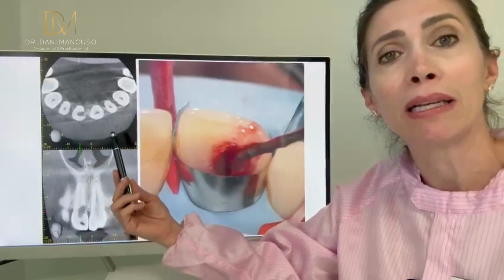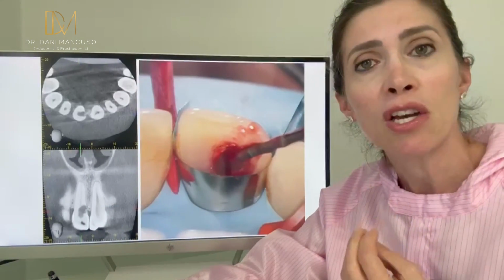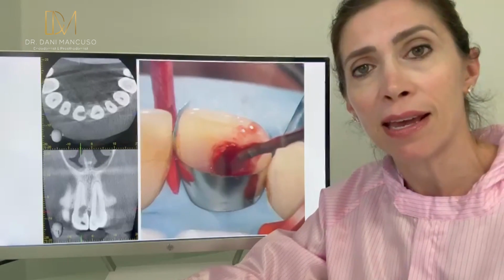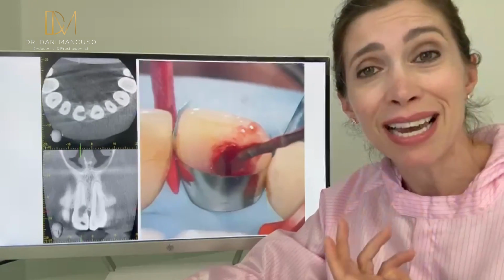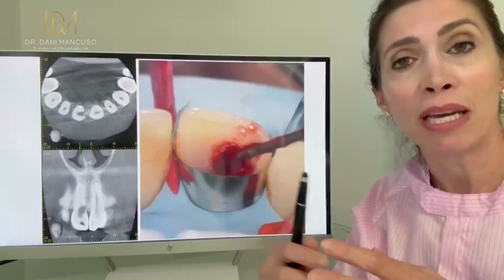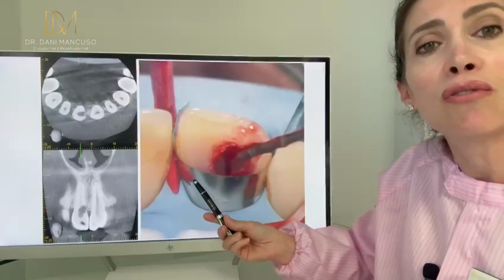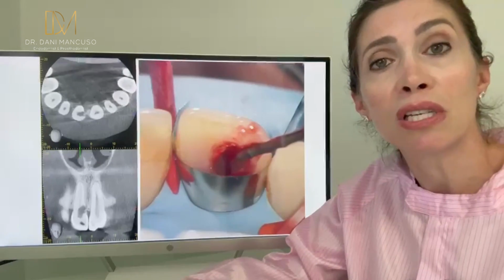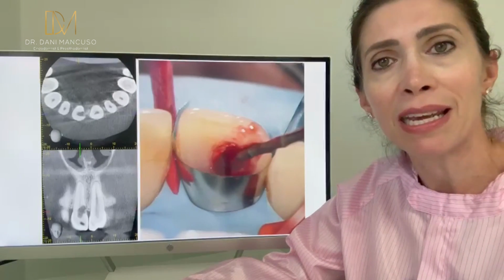So in my case, we were quite lucky. There was enough tooth structure, and there were just a few points that I could see bleeding. So I cauterized those points and I managed to do the root canal treatment. If I can use sodium hypochlorite, just use a first drop and see if the patient is going to taste it. Make sure you adapt a matrix, and you can isolate that matrix. If your rubber dam is compromised, you can put some putty underneath. So you can do as much as you want. You will see on the other slide, I put the putty as soon as I started using the sodium hypochlorite. Clean that completely, wash, do your root canal treatment, carry on with that.